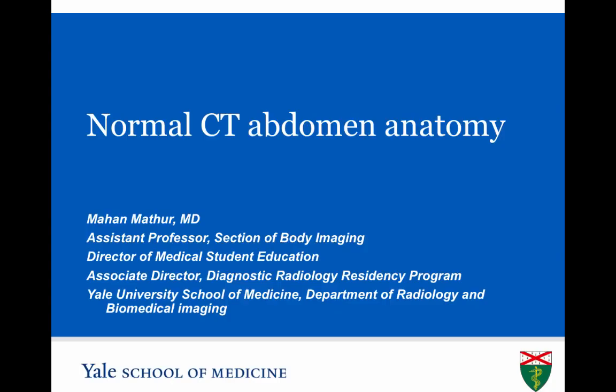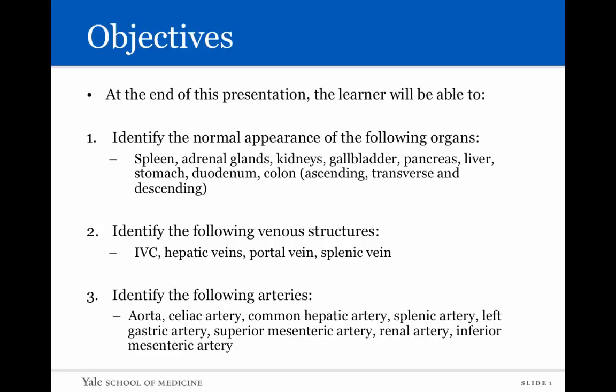The following video will cover normal CT abdominal anatomy. We have a couple of objectives. At the end of this presentation, the learner will be able to identify the normal appearance of a variety of organs within the abdominal cavity, specifically the spleen, adrenal glands, kidneys, gallbladder, pancreas, liver, stomach, duodenum, and portions of the colon.